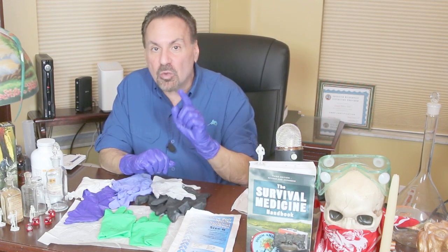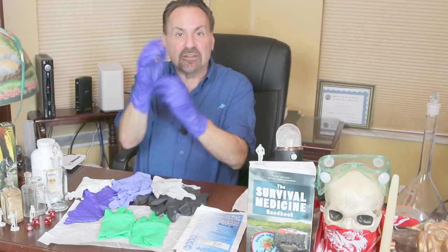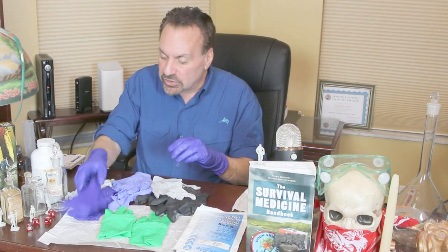Gloves are often separated into exam gloves and surgical gloves. Non-sterile exam gloves are used for evaluating patients, performing blood tests, and disinfecting, usually coming in sizes from small to extra-extra-large. Surgical gloves are used for medical procedures and must meet higher quality standards, with more precise sizing to increase tactile sensitivity. Surgical gloves are often numbered, with the most common sizes ranging from six to eight and a half. Some gloves have extended wrists for delivering a baby or other work requiring deeper protection; others have textured fingers for a better grip.